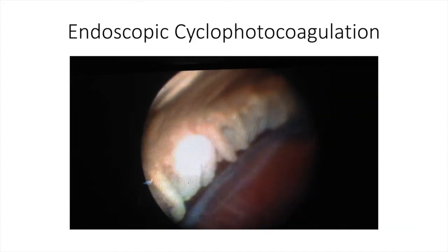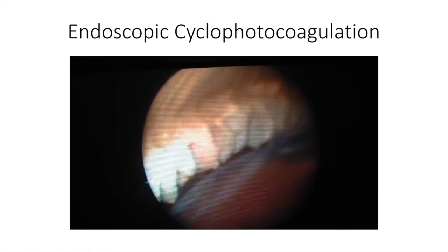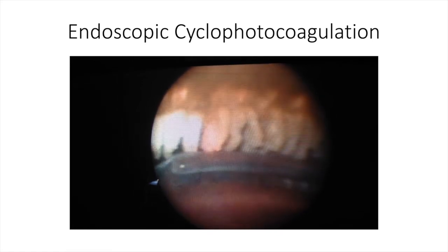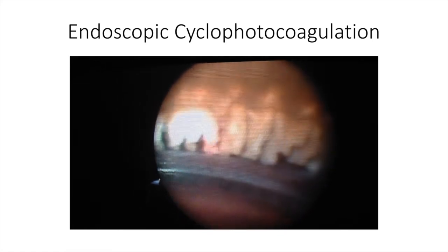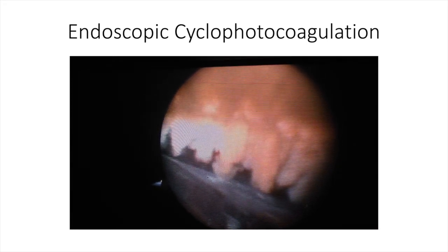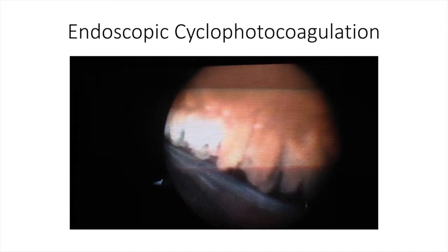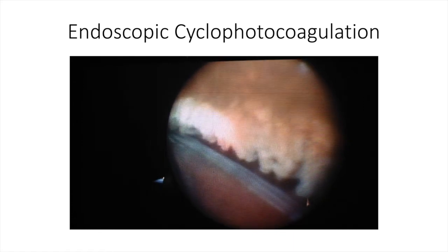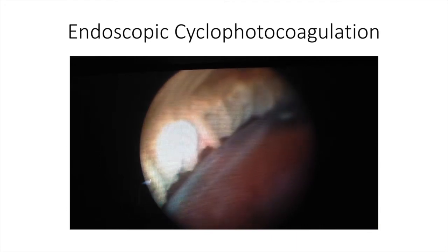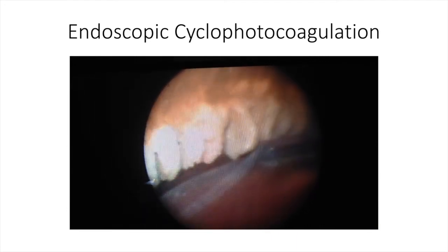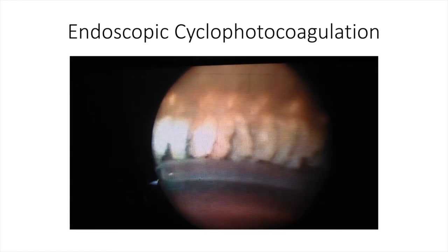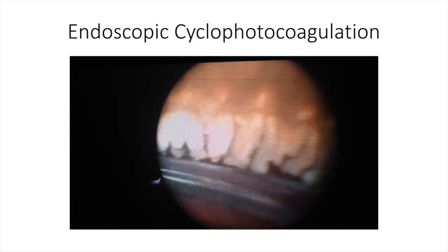Here's a video showing the painting motion. You can see the contracting, whitening, and shrinkage of the ciliary processes. I don't take my foot off the pedal — I'm continuously painting back and forth. Towards the end of the 360 degrees, I'll go back and paint once more. Each time you see a shrinking of the ciliary processes, you're exposing more of the ciliary epithelium that you might not have had a view of prior to the shrinkage. So remember: keep your foot on the pedal, use a painting motion, wait for whitening and shrinkage to get the epithelium between the processes, and consider a retreatment after your first sweep of 360 degrees.